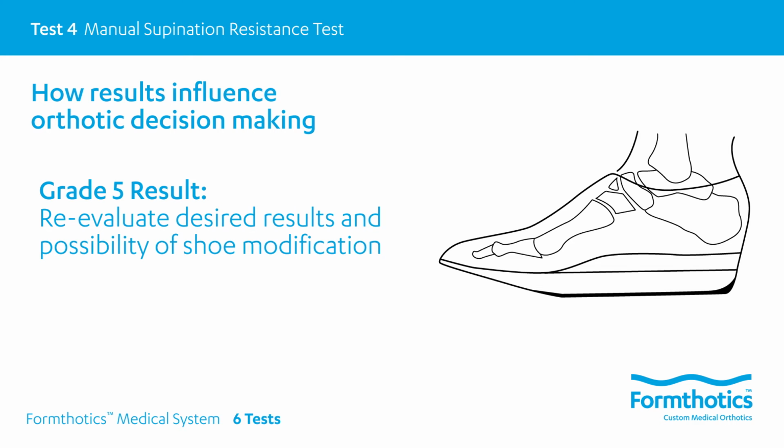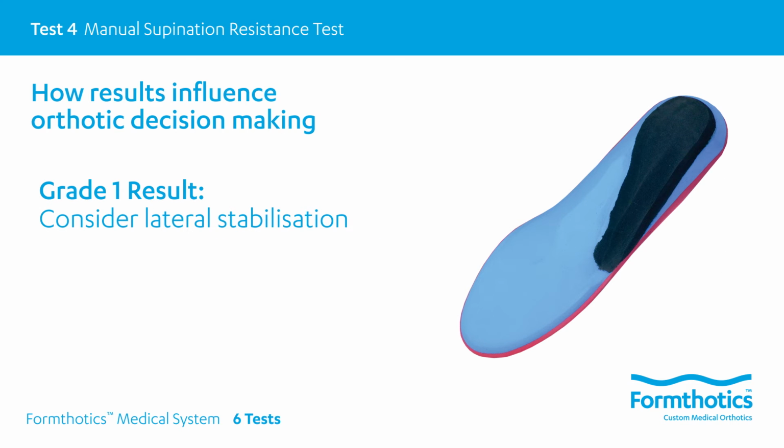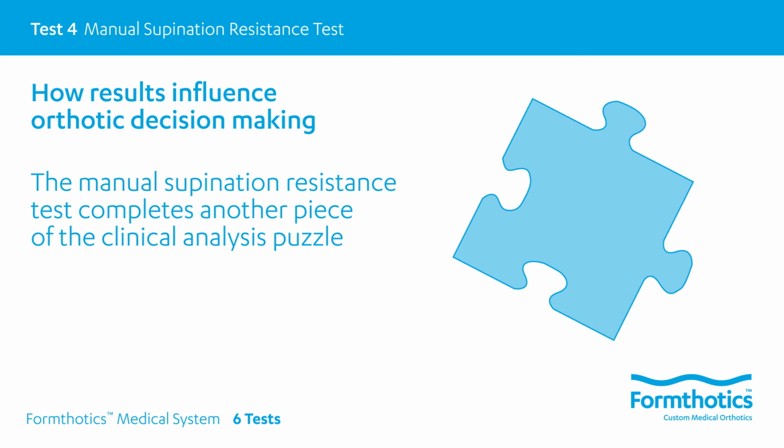Shoe modification with the use of medial flares and forefoot rockers may be considered in conjunction with full contact accommodative Formthotics. For a grade 1 result, lateral stabilization and support become a large part of the clinical Formthotics management goal, especially if the symptoms, pathology, or dysfunction are in any degree contributed to by the lateral instability due to very low supination resistance. The manual supination resistance test completes another piece of the clinical analysis puzzle.